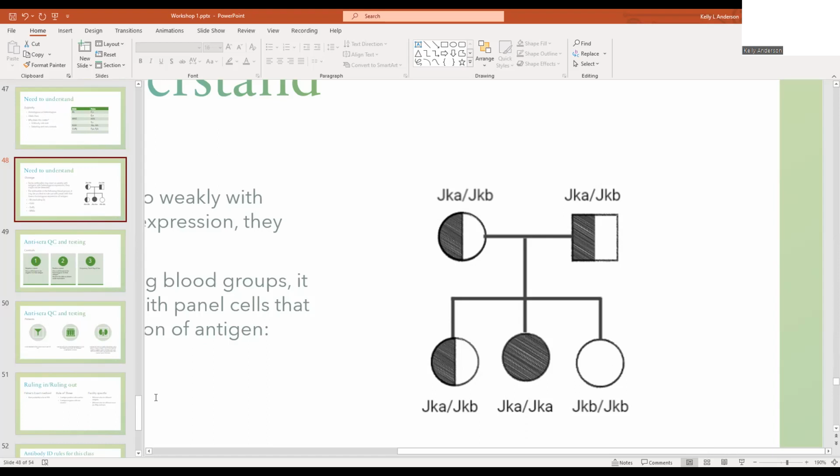Wait, did you give me that one? Oh, wait, yeah. I'm sorry. So how do you know which one you're looking at? Exactly. So the cards have what kind of card is on it. So it'll say ABO card or anti-IgG card or antiserum card. So there's an antiserum card and then there's an ABO card. I didn't get it yet. What should I have?